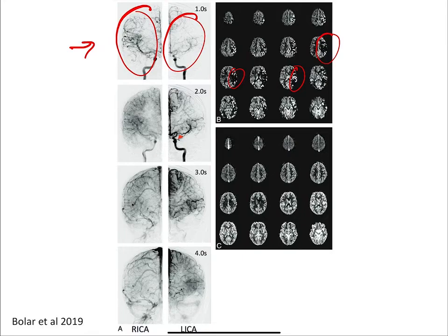Okay, down here, same subject, it looks better, right? So from a clinical point of view, this is really important because the diagnosis of someone with no blood flow versus just delayed blood flow is actually going to have different consequences.